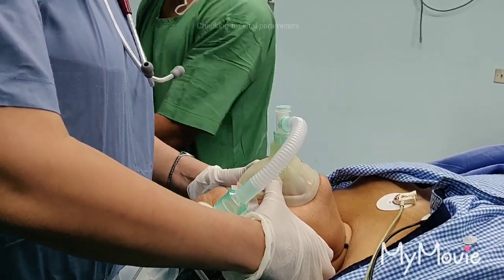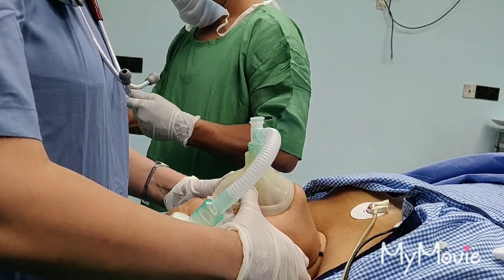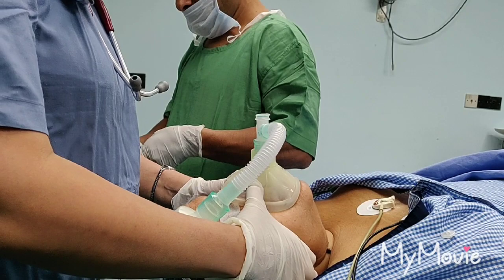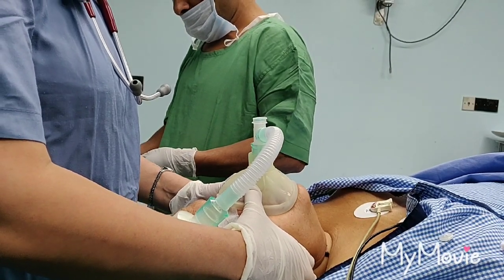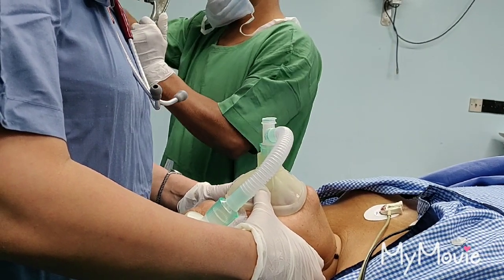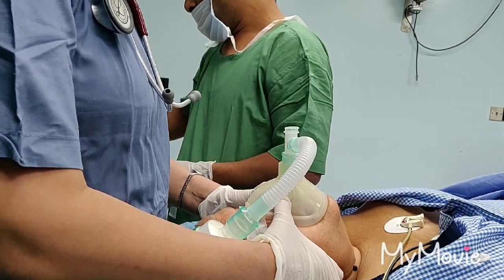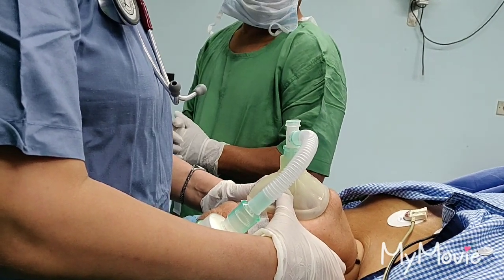Take the blood pressure once. Keep your hands steady. Pulse is good at 90. Saturation 100%. Good ETCO2 curve. Achieving tidal volume — set tidal volume 450. Respiratory rate is 12. 100% oxygen being delivered. Good chest expansion.